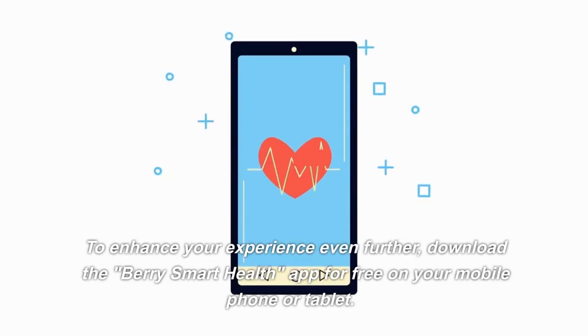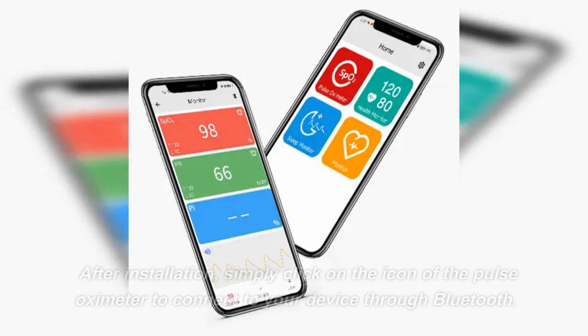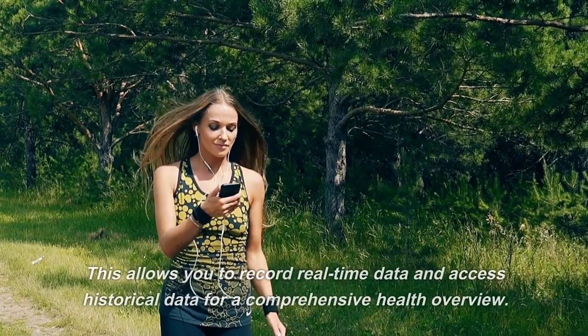To enhance your experience even further, download the Berry Smart Health app for free on your mobile phone or tablet. After installation, simply click on the icon of the pulse oximeter to connect to your device through Bluetooth.